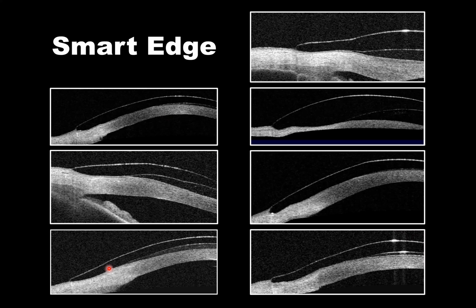Notice the vault through the corneal tissue, the vault through the limbus, the vault through the initial conjunctiva, and then this beautiful relationship of landing on the eye surface. Compare this to the other 6 lenses that you see there. You'll notice that every scleral lens has its own signature. And I would argue that the signature of the SmartLens is really idealized for landing on the conjunctival surface.